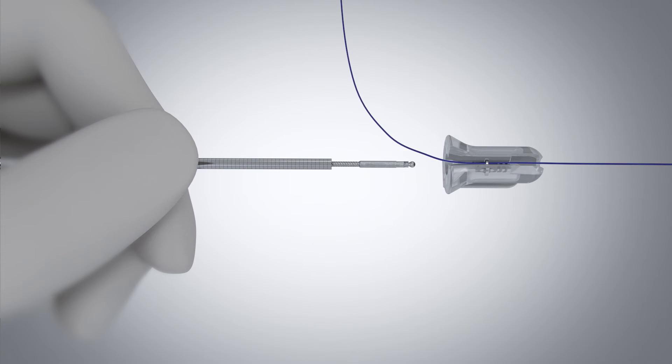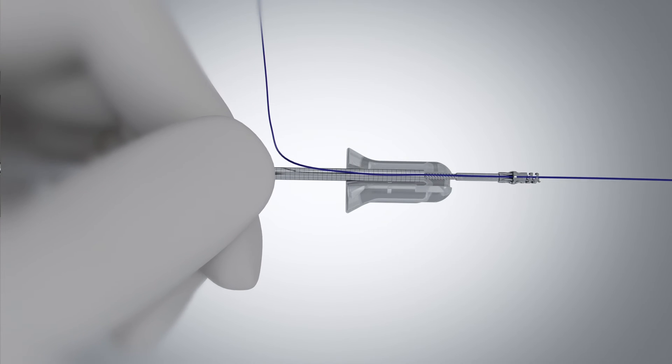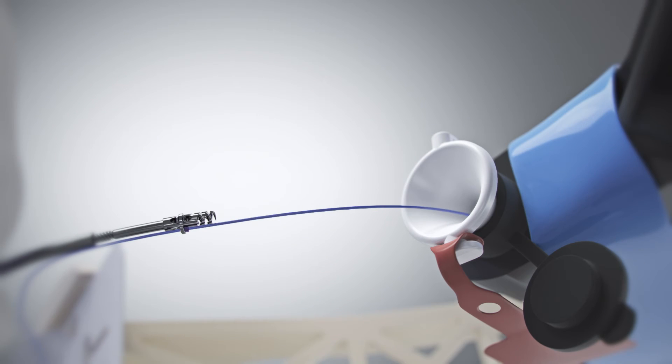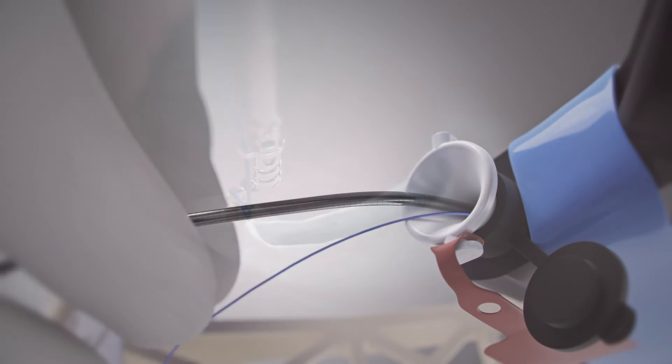Reload the second helix TAC by securing the distal end of the catheter and advance the driver into the reload pill until the driver engages. Continue to advance, then remove the catheter with loaded helix TAC. While holding tension on the suture, slowly advance the helix TAC along the suture into the working channel.